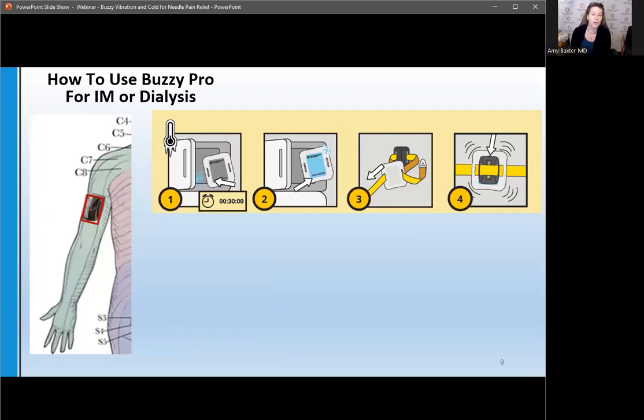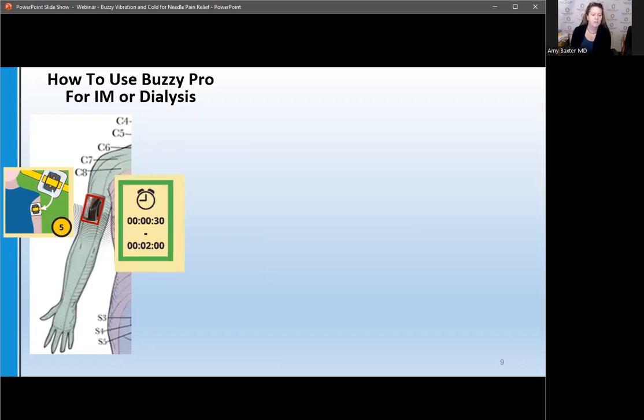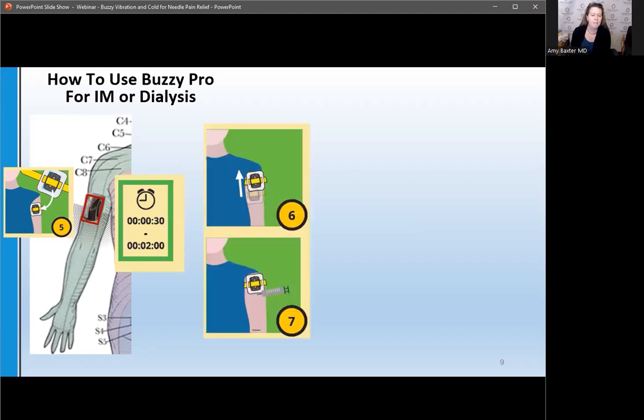So you put the Buzzy where you're going to be doing the cannulation or the IM, and you strap it in place, you can hold it in place, but it needs to be there for about 30 seconds. So the 30 seconds to 2 minutes, depending on the degree of pain. And then when you're ready to do the cannulation or the injection, you're going to slide the device up so that you can, step 7, put the painful part where Buzzy has just been. So Buzzy Pro is moved up, and then that is where you do it. So that's the area where you're cannulating.